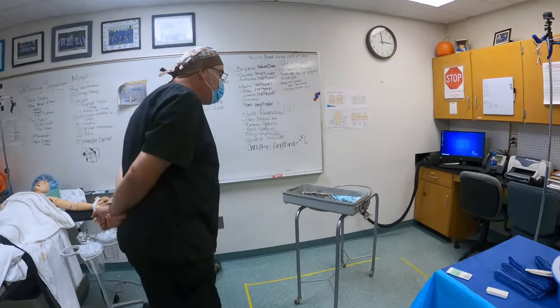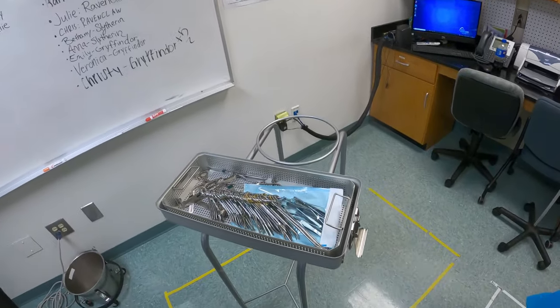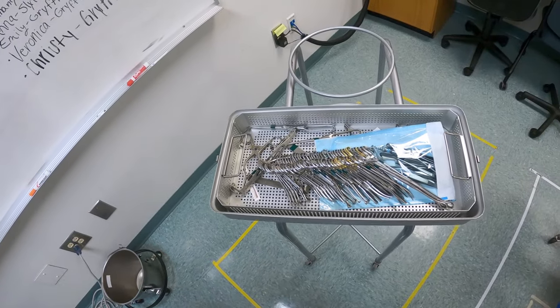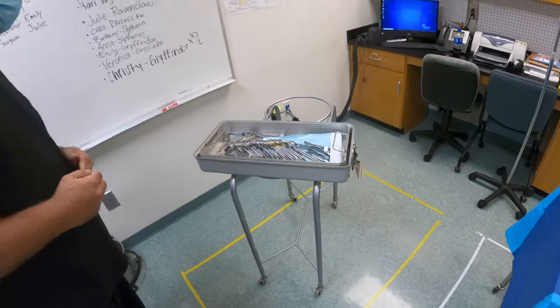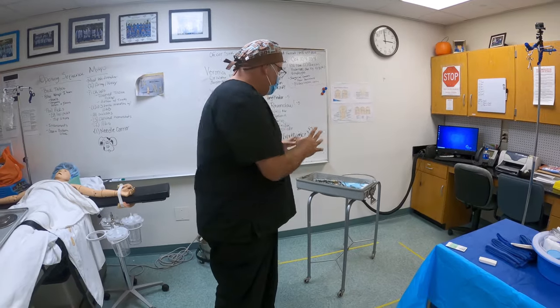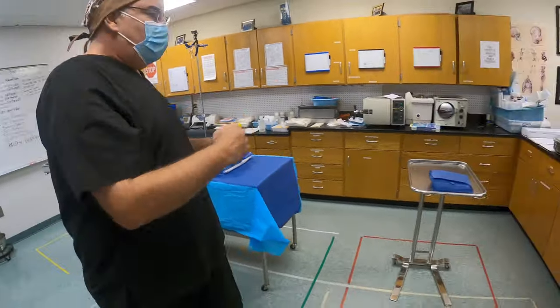Now I'm going to come over here — not getting too close, but looking in to see if I can see my sterile indicators. I've got one; it says okay, so I'm probably okay. If I couldn't see it at this point, I would want to take note of that because it's going to change what I do in a few minutes. So once that's open, my back table is open. Go to my mayo stand.